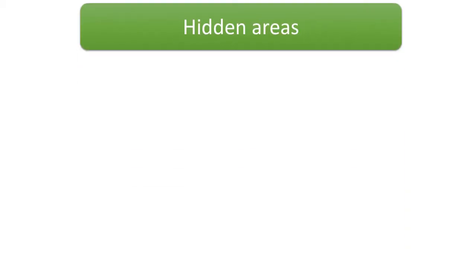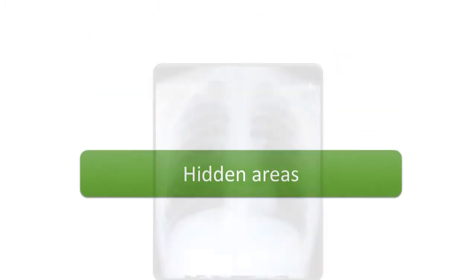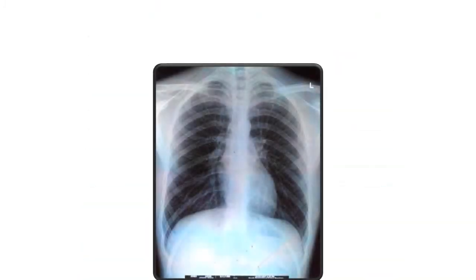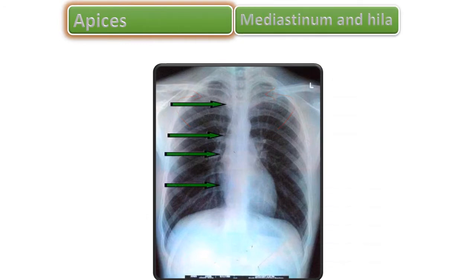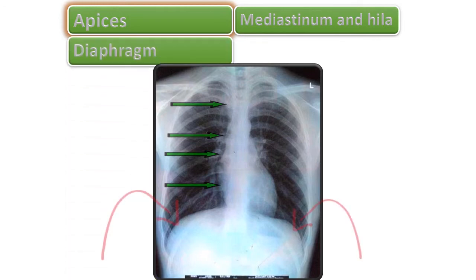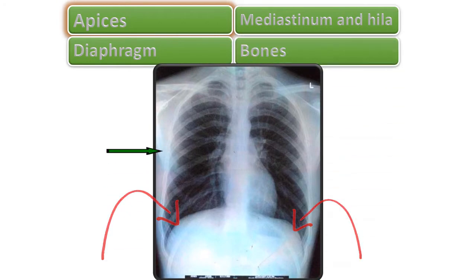This is a diagrammatic image summarizing the hidden areas in a chest X-ray. The hidden areas are: the apices (red arrows), the mediastinum and the hilum (green arrows), the hemidiaphragms on both sides (curved arrows), and the bones.